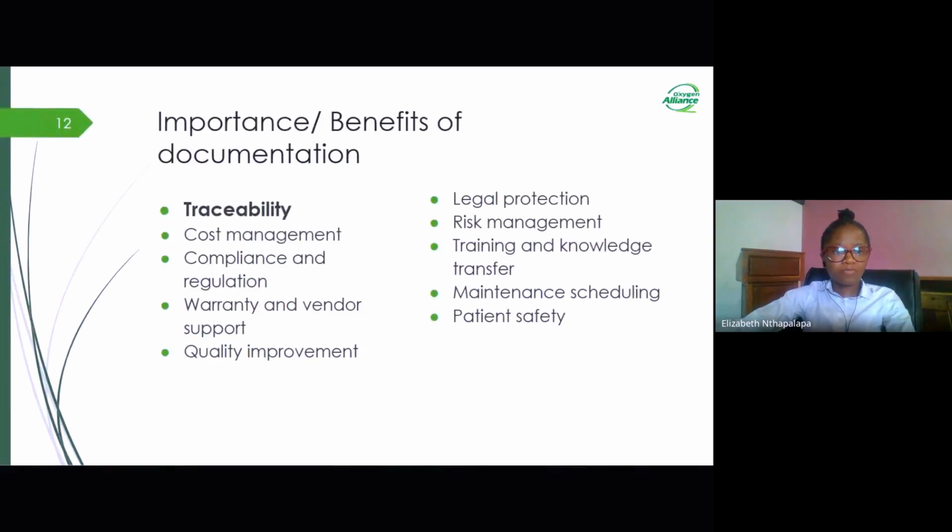Here with me, I have different reasons, and the first one is traceability. Documentation provides a complete history of an equipment's maintenance and usage. This traceability aids in identifying issues, tracking repairs, and even making informed decisions about when to replace or retire an equipment.